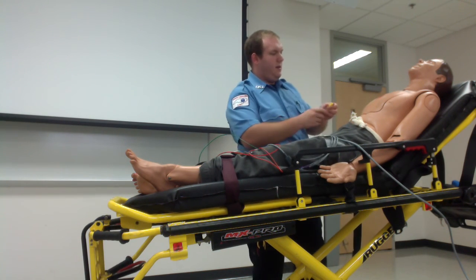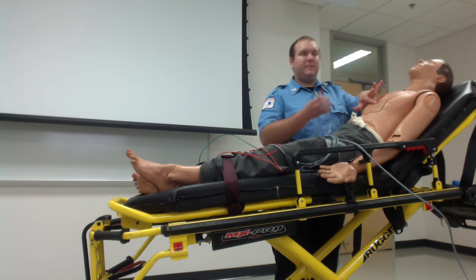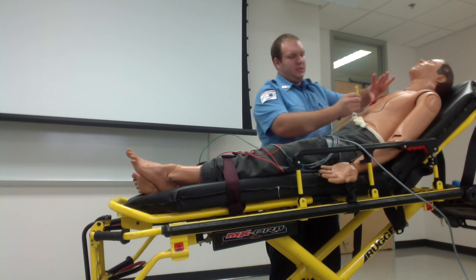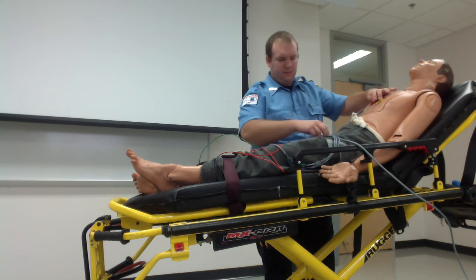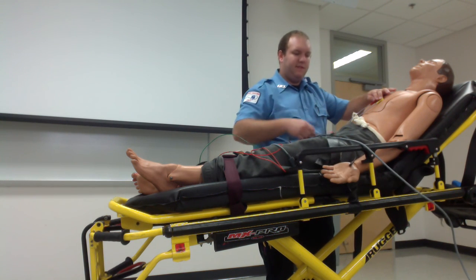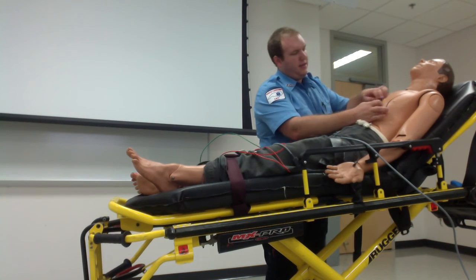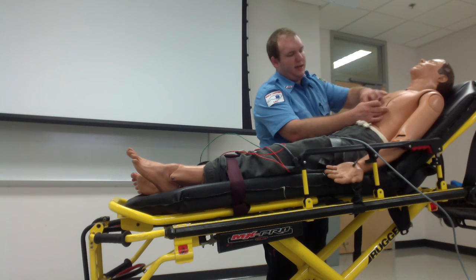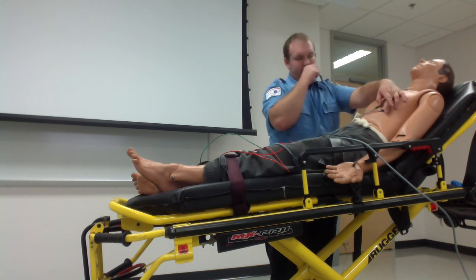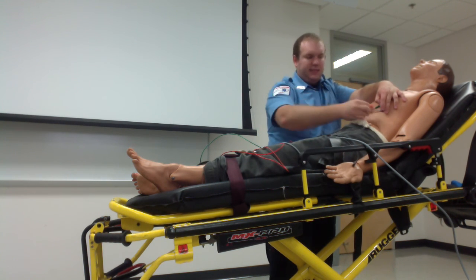As you find it on your patient, look for that 4th intercostal space. V1 goes right down the right side of the sternum. V2 goes right there on the left side. Then you'll find V4, in the 5th spot, right there in the nipple line, mid-clavicular line. You'll stick it there. V3 will go right in between it and V2. V5 and V6 will then go around the outside.